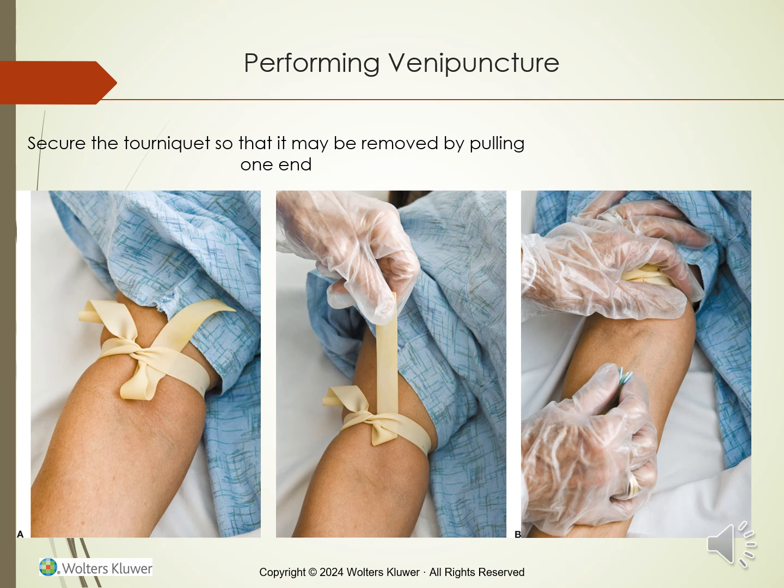When performing a venipuncture procedure, you want to confirm the patient's identity and check for any latex or iodine allergies, and explain the procedure clearly and address any questions the patient may have. Prior to starting venipuncture, you want to perform hand hygiene, whether that is washing with soap and water or using an alcohol-based disinfectant.